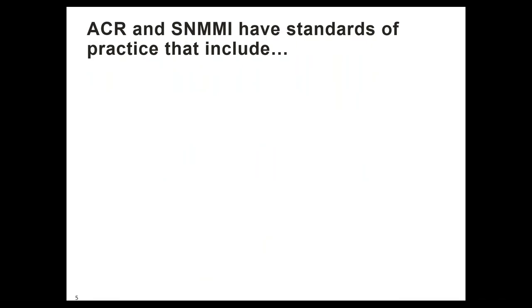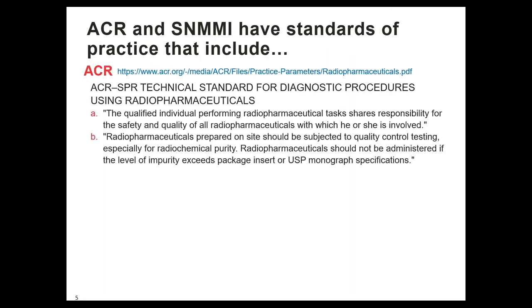Let's look at the standards of practice, both of the American College of Radiology as well as SNMMI. So ACR comes first alphabetically. Here's the link to their document. It's their technical standards for the preparation for the diagnostic procedures using radiopharmaceuticals. The qualified individual performing radiopharmaceutical tasks shares responsibility for the safety and quality of all RPs with which he or she is involved. Radiopharmaceuticals prepared on site should be subjected to quality control testing, especially for radiochemical purity. Radiopharmaceuticals should not be administered if the level of impurity exceeds package insert or USP monograph specifications.